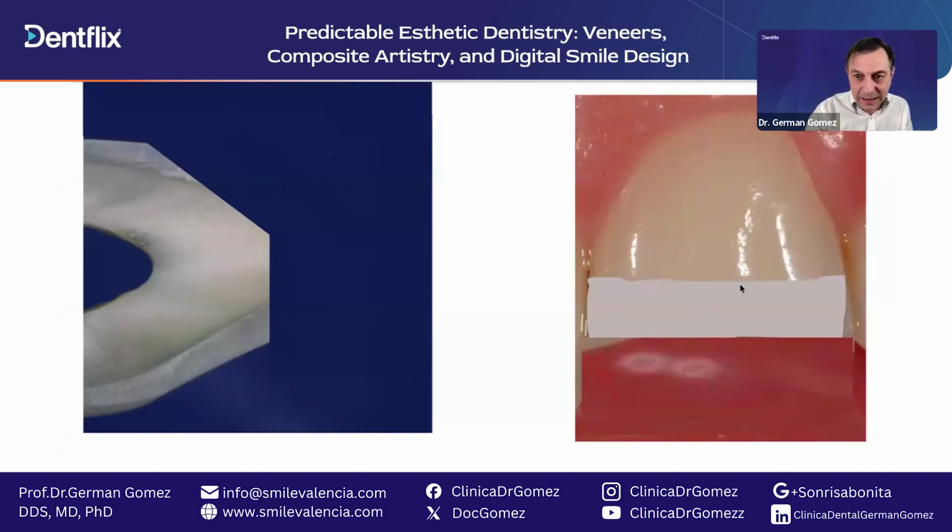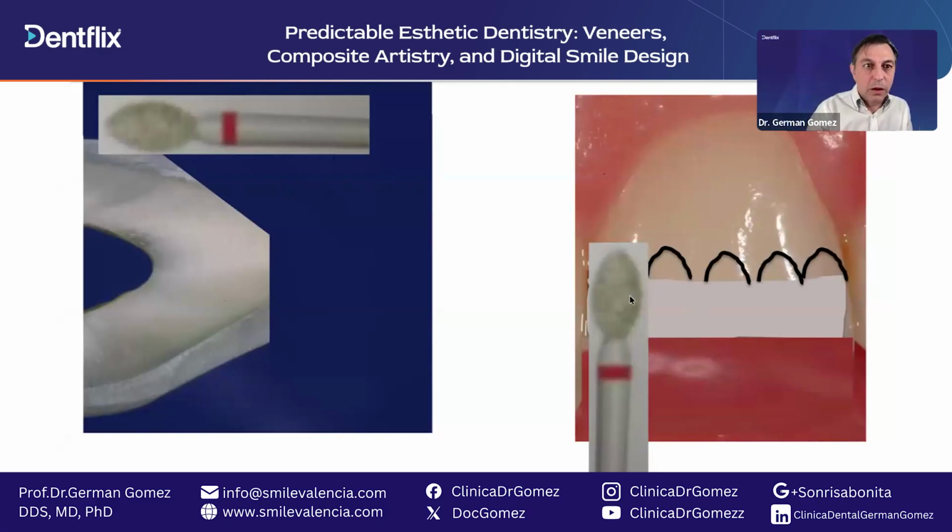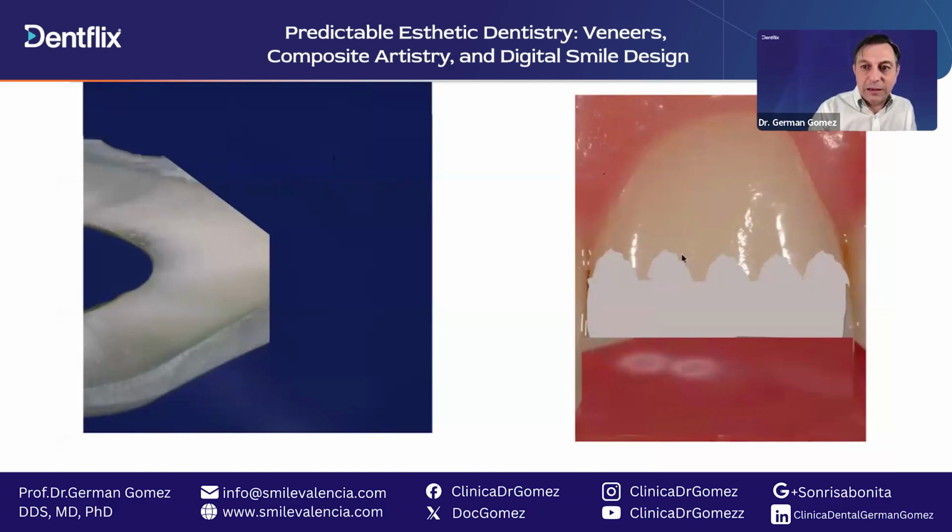But now we have this line here. How do we make that disappear? Well, we double bevel. The next bevel will be to make irregularities there. How do we do these? With a rugby-shaped burr. Of course these irregularities have to be outside this line so that in the end it looks irregular.